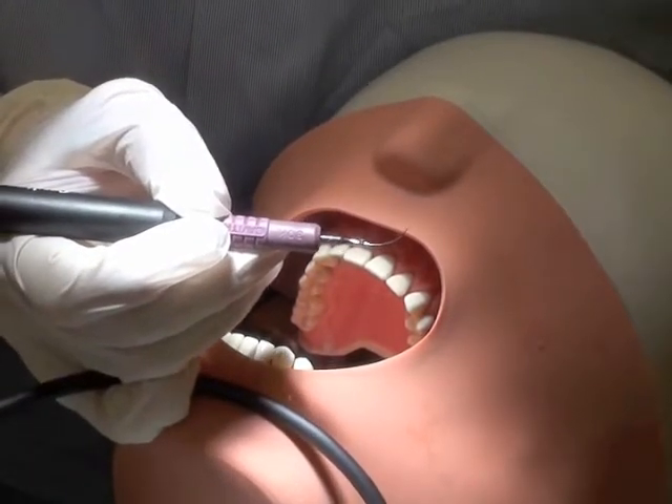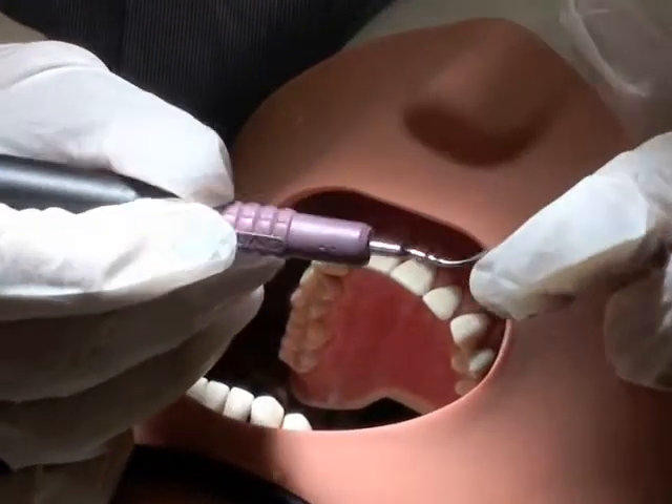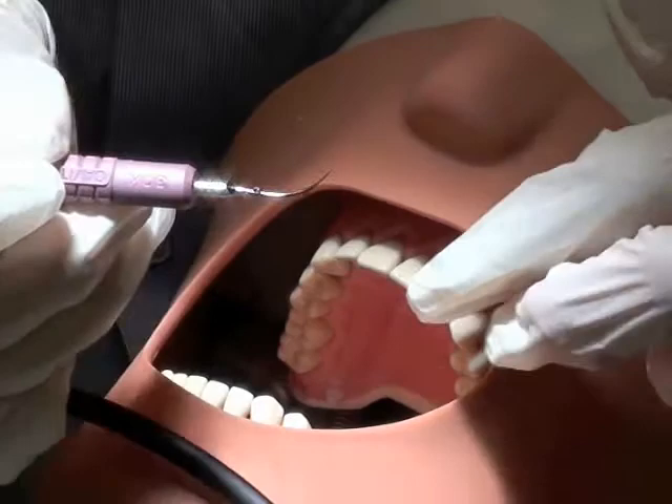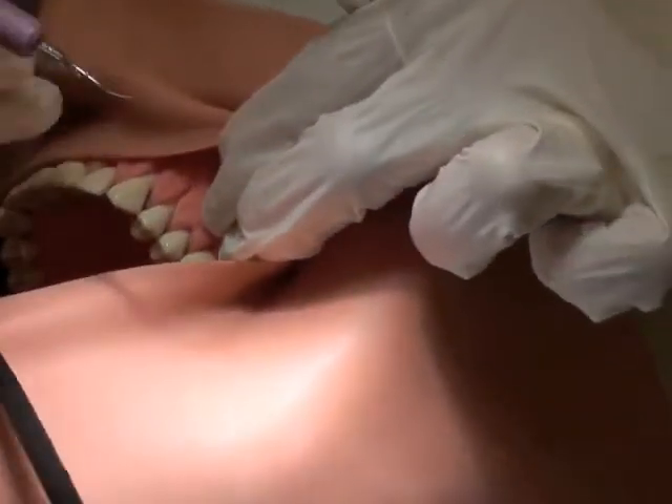With the regular universal, working at a high power could fracture the tip. With your purple thinsert, you're going to be able to use it at a higher power, but it's adapted the same way, and I'll just demonstrate that on premolars here.